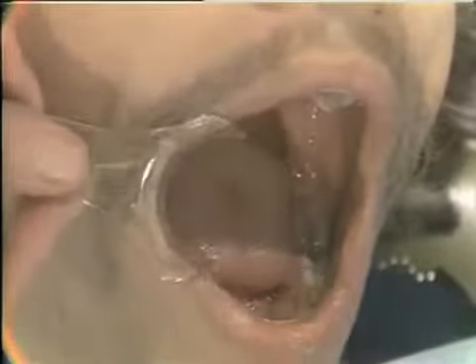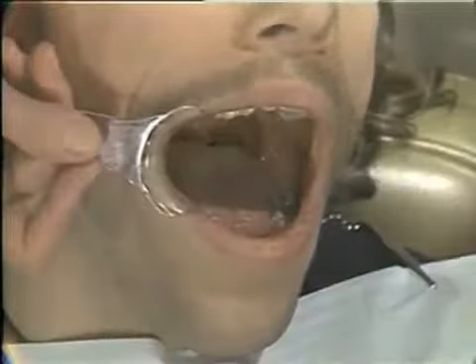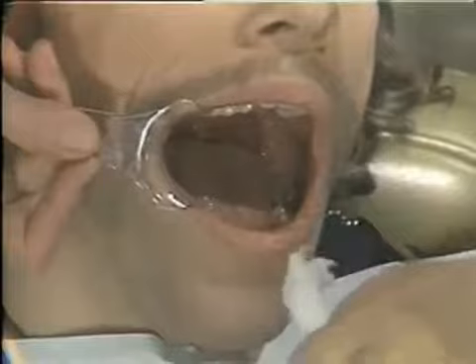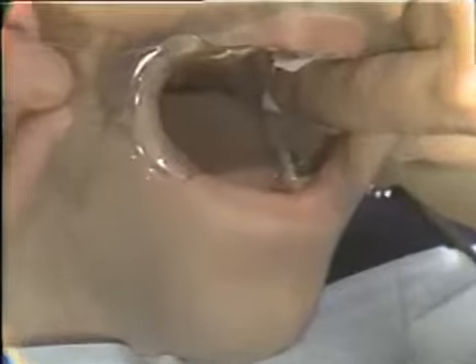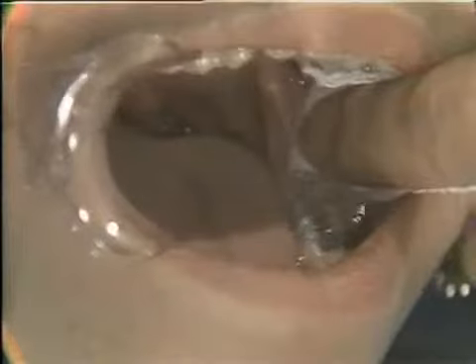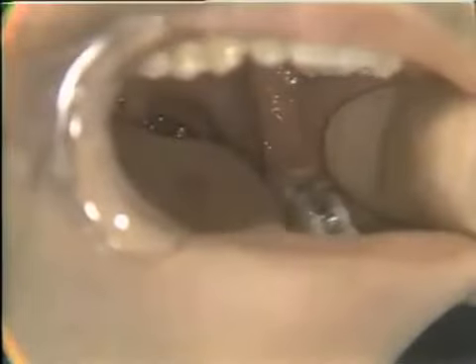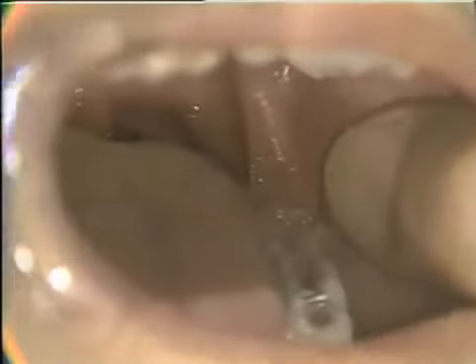Now, to demonstrate drying the mucosa back in this area, you will notice that I do have a gauze strip here that I have unrolled to its fullest length, and I place my index finger over the end of it in this fashion, and we just kind of sneak along his occlusal plane and just lay it on the mucosa in that area. Don't wipe, because many patients will gag if you stimulate them in that fashion. I just lay it there for a few moments, and then with my left hand I remove the gauze, and at the same time my thumb is going in to get our landmarks. We have the mucosa dry. I do have my landmarks, with my thumb and second finger on the posterior border of the ramus.